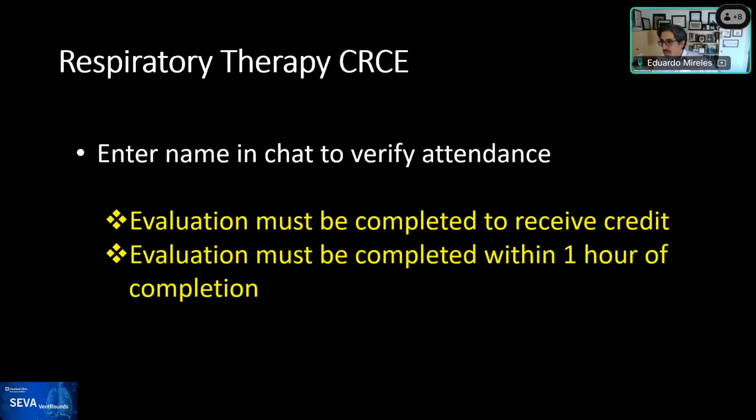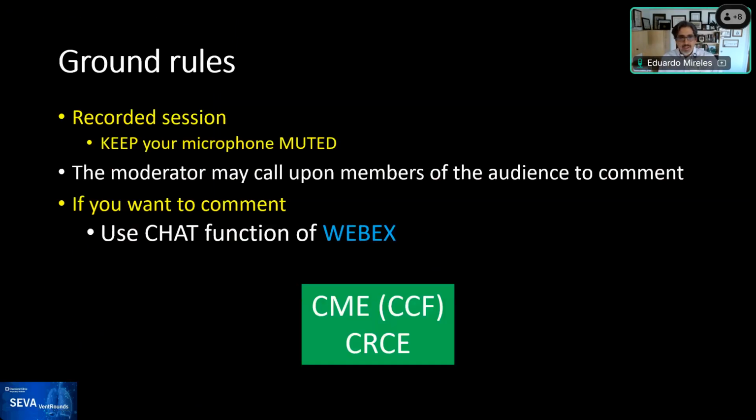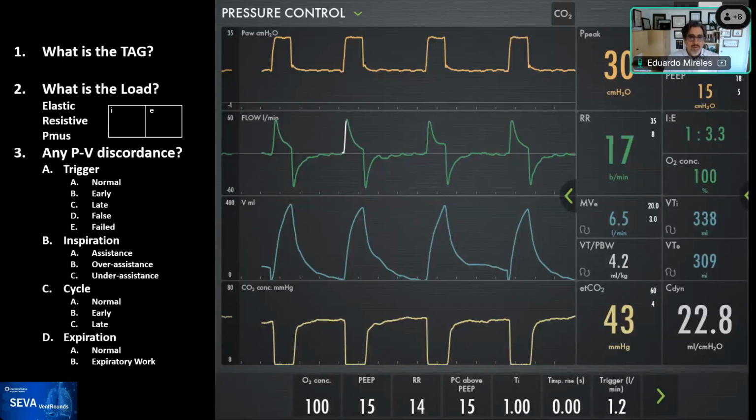So I decided we were going to jump straight into it. This is fresh out of the oven. This is a patient that I was walking today and I saw, and then I'll give you some of the background, but I think that we should take a look at the image and go from there. So here it is. And I'm going to pause, if you're watching this in a video later on, just pause it here.